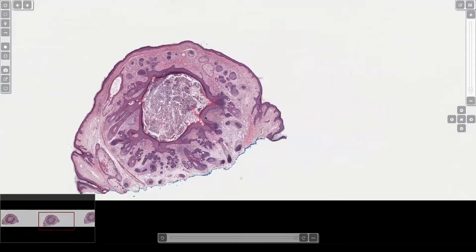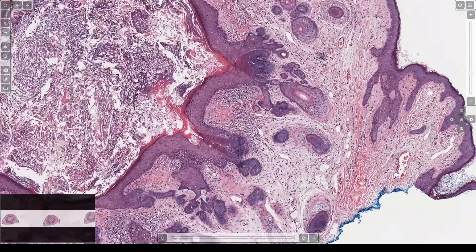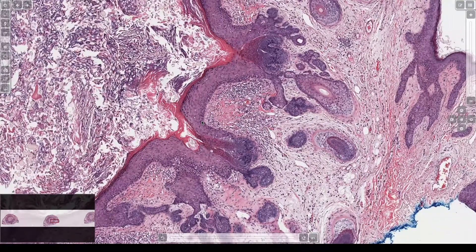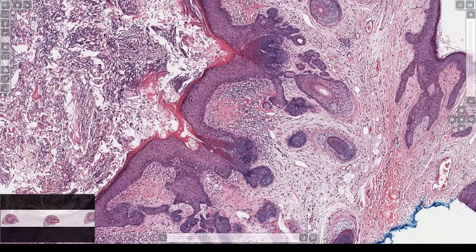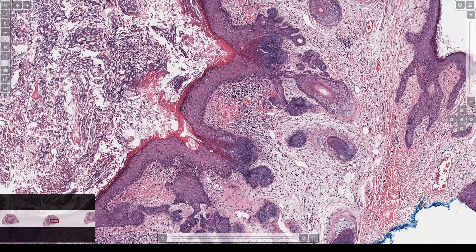And the center, the central cyst will look very similar to like a follicular and fundibular cyst or what some pathologists call it, epidermal inclusion cyst. And it'll have a granular layer and a flaky loose keratin.